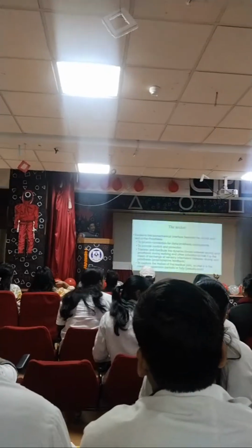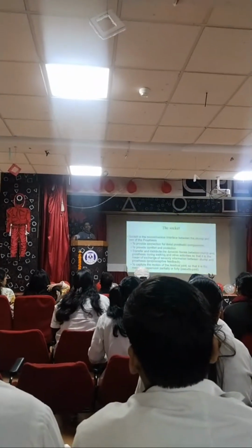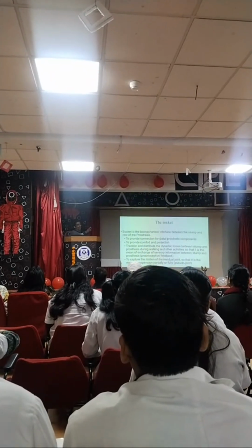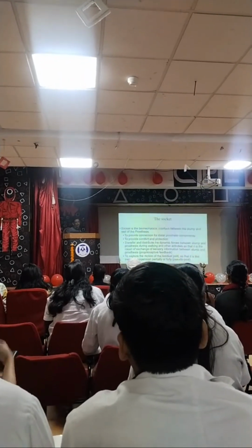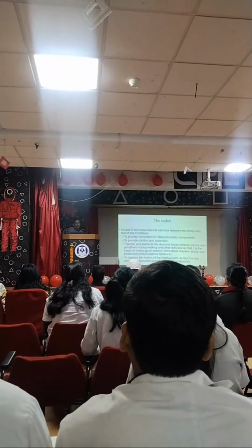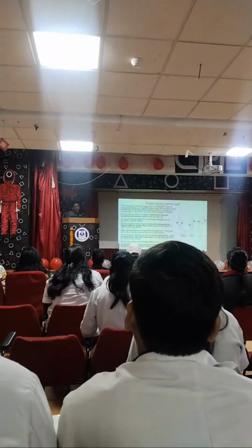But that is very difficult in a tropical country like ours, and therefore socket designs of different varieties are there that we will be learning. They are going to help in providing the capturing of motion of the residual joint. What happens when the patient walks?